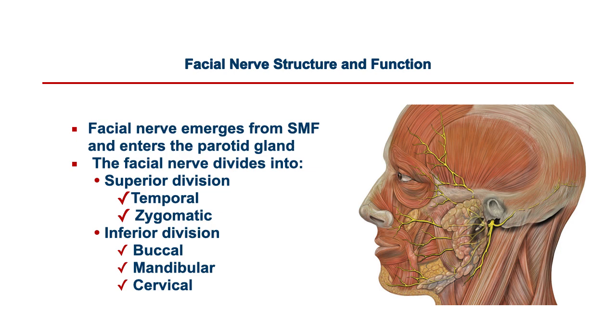And then we have to record it somewhere, and we usually record it in this fold or crease between the base of your nose, the outside of your nose, and the corner of the mouth. It's called the nasolabial fold. And we'll talk more about that shortly.